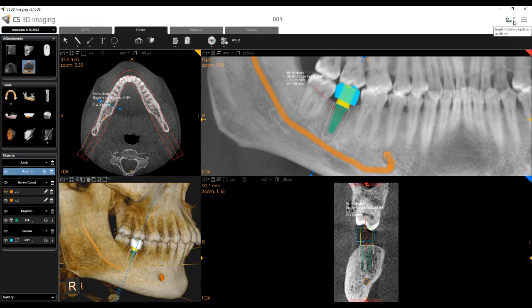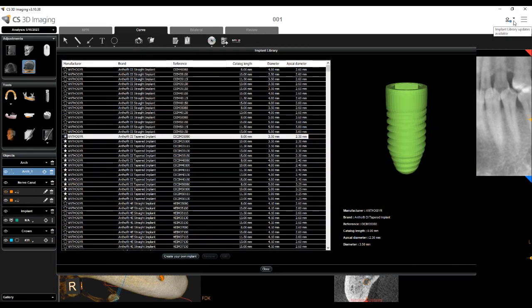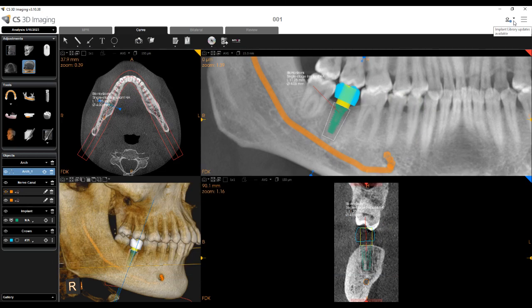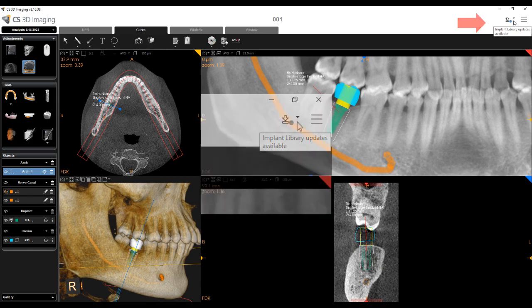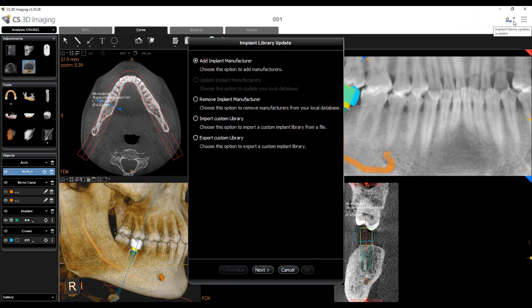CS3D Imaging provides a library of virtual implants for use on the Curve Slicing tab. You can add and remove manufacturers and import and export custom implant libraries. When updates are available, a blue dot update icon appears in the CS3D Imaging Main Toolbar. To update the implant library, verify that the computer is connected to the internet, then click the update icon. The implant library update window appears.